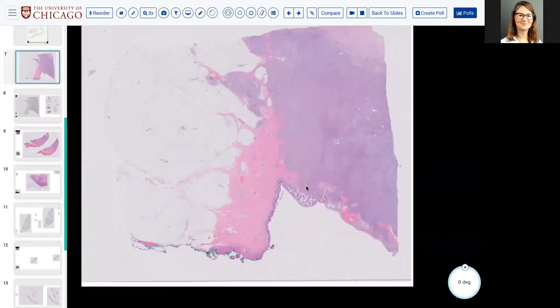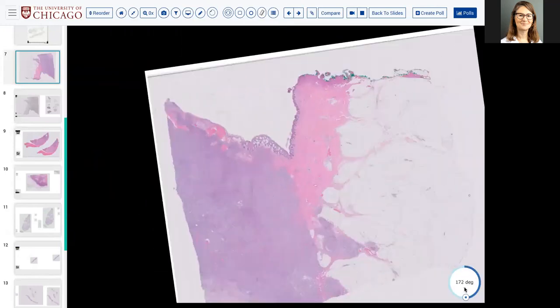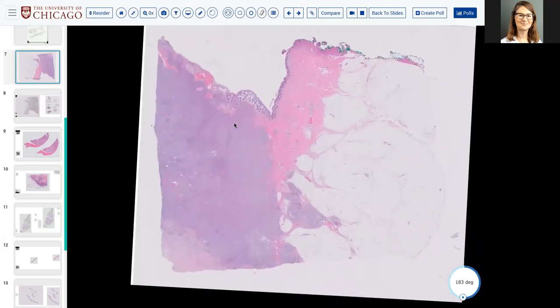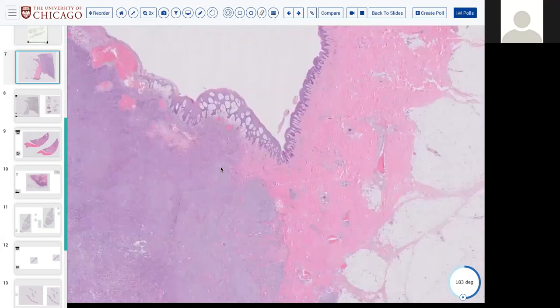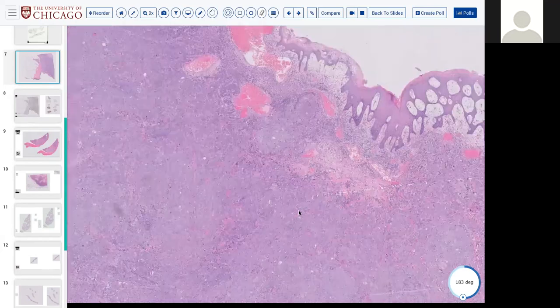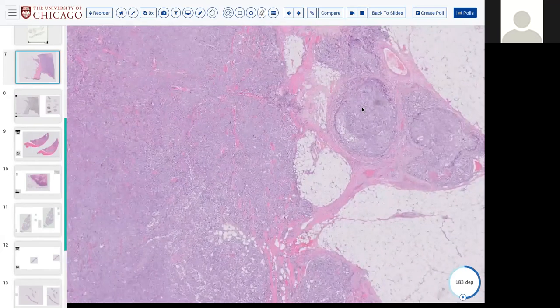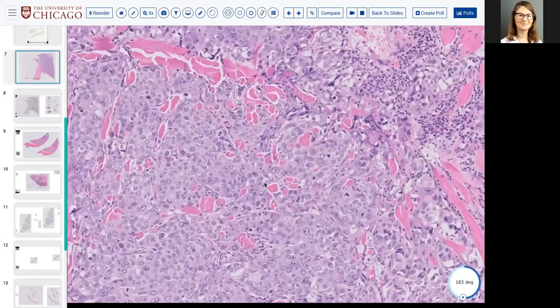Next, also in the skin. I did not give you guys the IHCs here on your preview cases, but I have a few, as you can tell here. So does anybody want to describe this one? I can describe this one. It's under the epithelium here, and it's an ill-defined, very basophilic lesion with really pleomorphic. I'm sorry, it's a little bit blurry on my computer screen here.